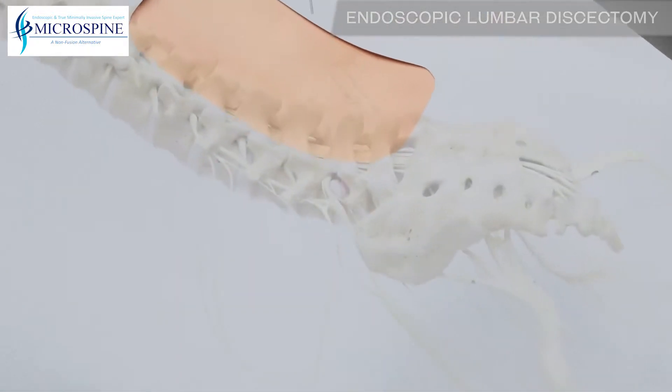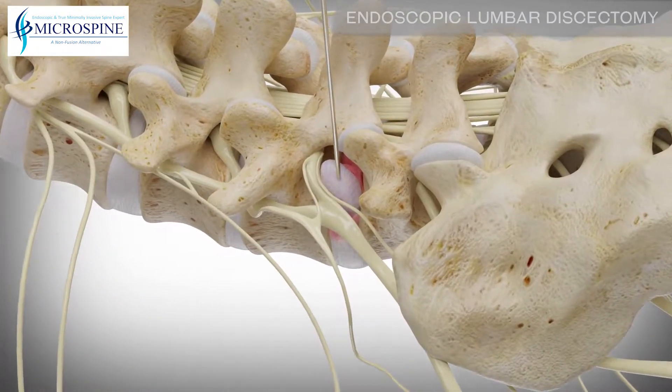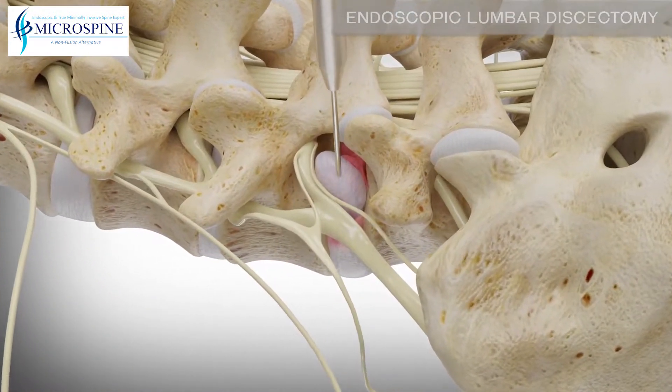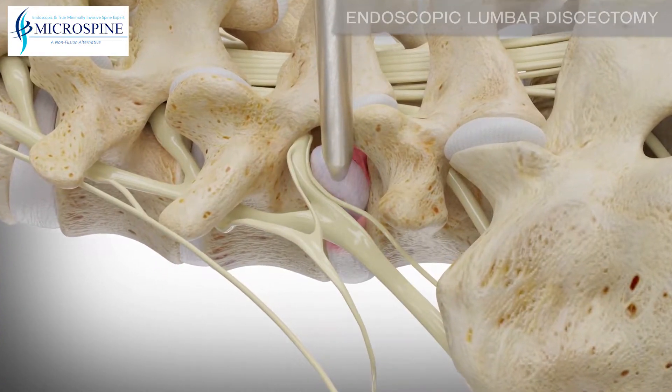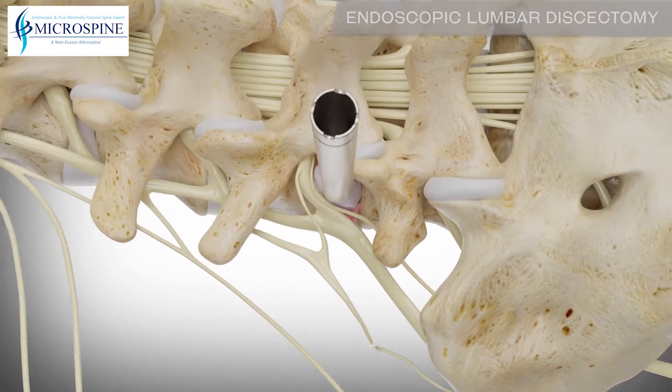The surgical site is located by placing a small guide wire into the targeted disc. A dilator, smaller than a pencil, is then placed over the guide wire. A tube is then placed over the dilator to create a portal down to the disc herniation.